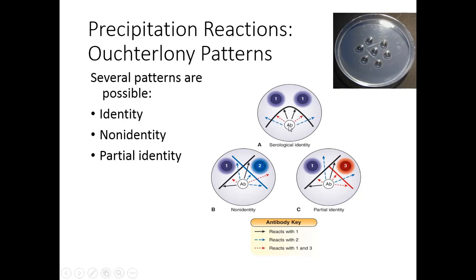And it diffuses out through the gel towards antigens that are placed in here. It doesn't matter which it is, but one's going to be a known, so a control, plus, say, a patient here. And in a real one, you do a known and a control, a known and a control, a known and a control.